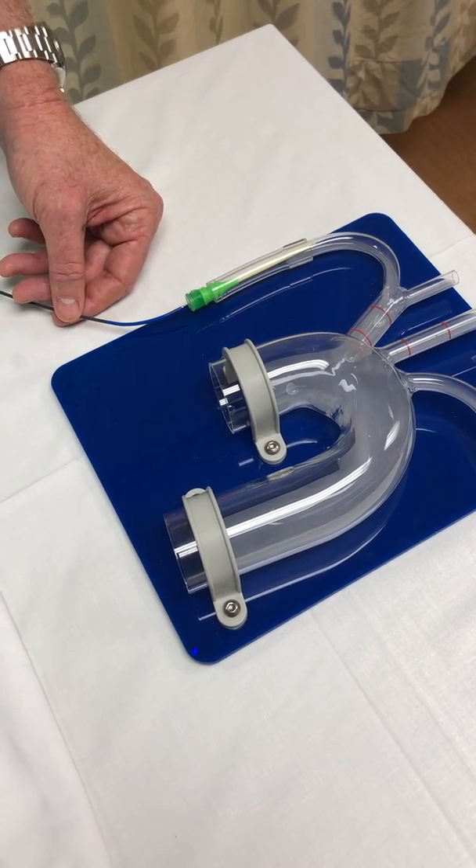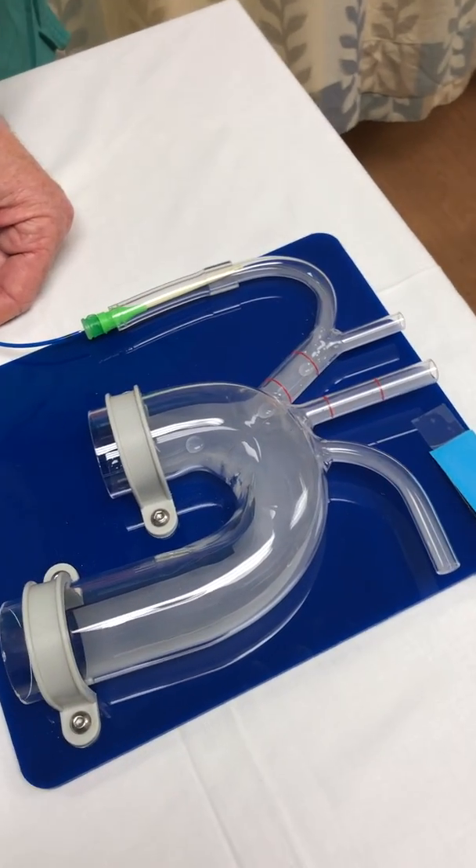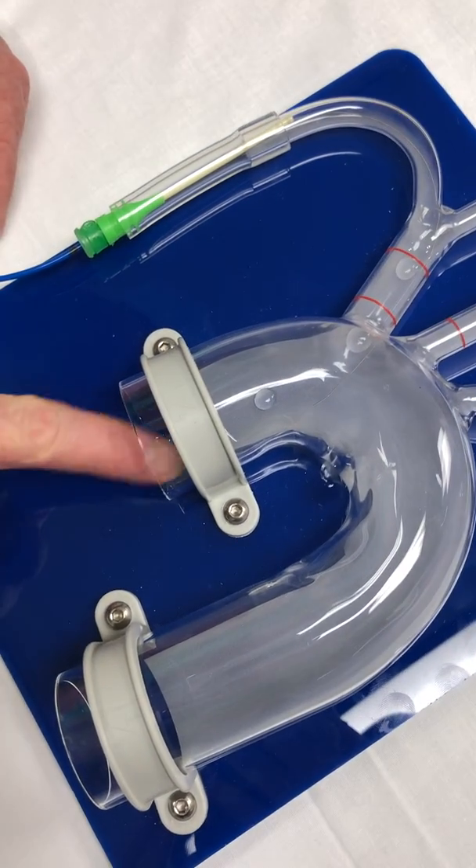The first thing we're going to do is go in. It's only placed through the right side, so we're going to go through our right radial 6 French sheath and advance the wire up into the innominate and down into the ascending aorta.